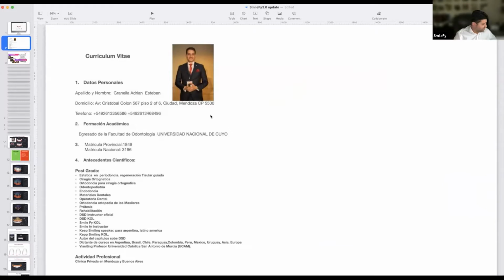We work with Smilefy together. We have unbelievable cases. Adrian is creating really very special cases. He's going to show one case, the result and the whole treatment that was done on this patient. It's going to be very intense, but I think very exciting.